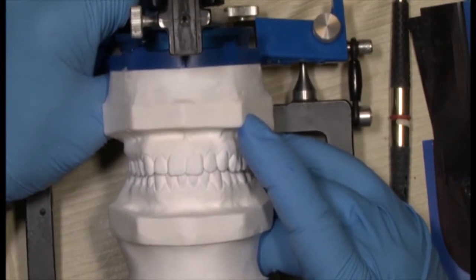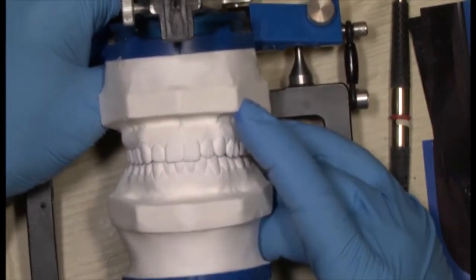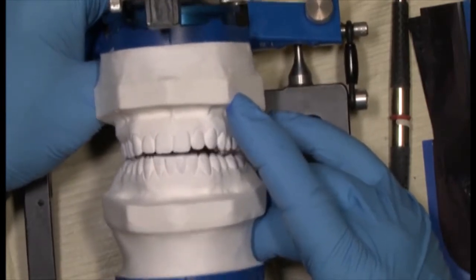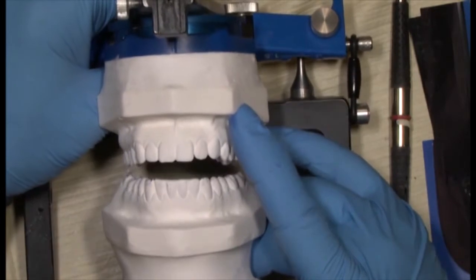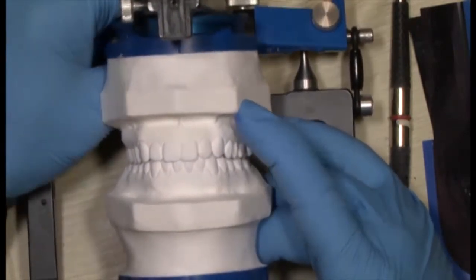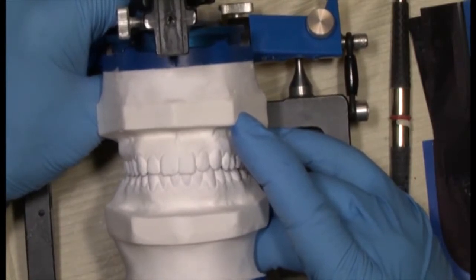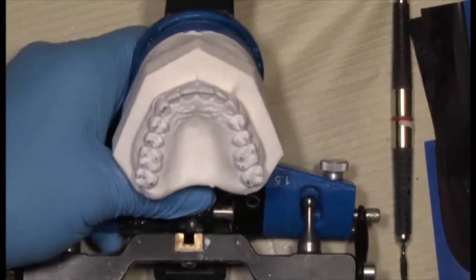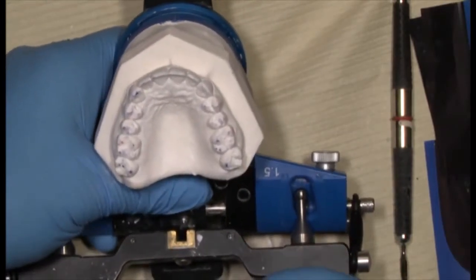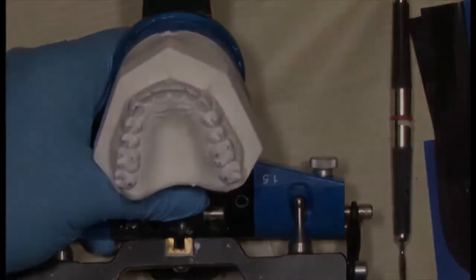Anterior guidance works best when you don't need it. In other words, as the patient closes up and down and chews, very rarely puts any load on guiding inclines. Most of the load is as this patient would be moving into MIP, not on inclines. At this point, I'm very happy with the end point for our trial equilibration, and I would have no problem going ahead to accomplish this in the mouth.